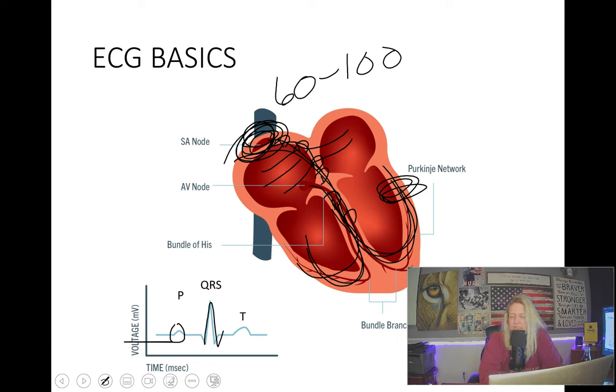Giving you just a chance to comprehend that. 4/100ths of a second. I can't comprehend that. I can't either. I'm just telling you, each small box represents 4/100ths of a second. So 2.5 small boxes is 0.10 seconds, which is 1/10th of a second.